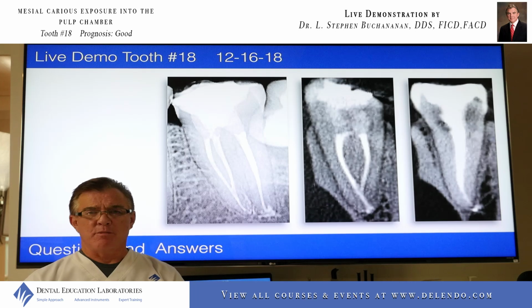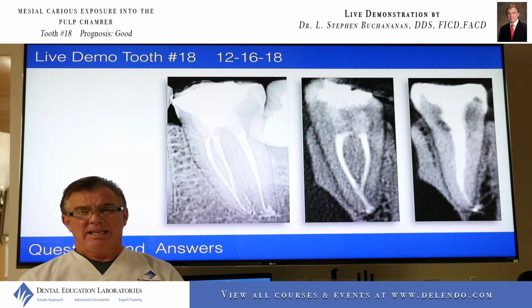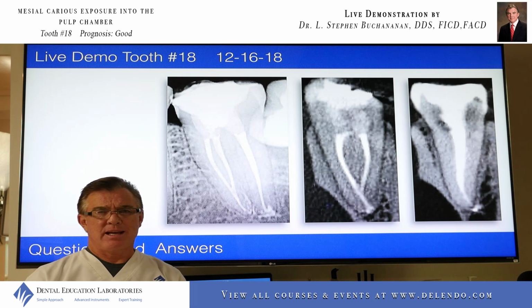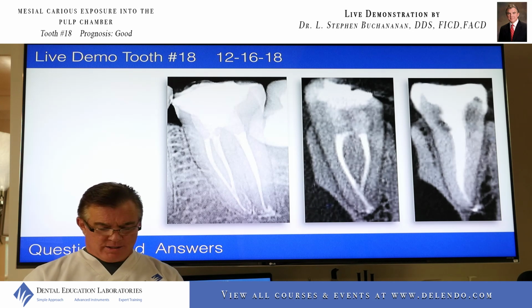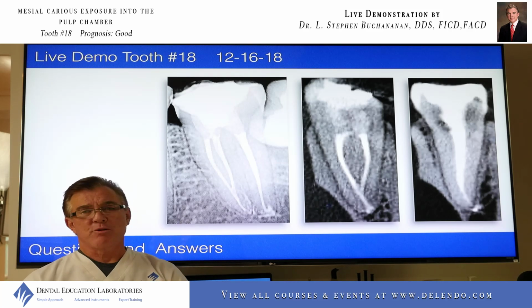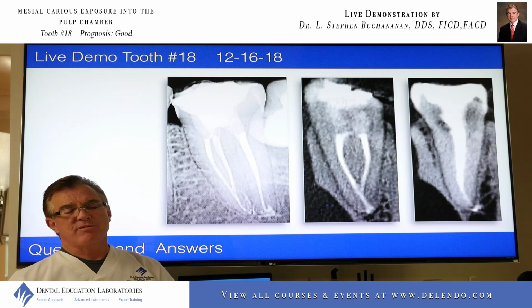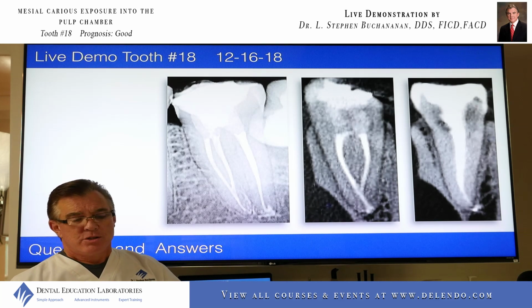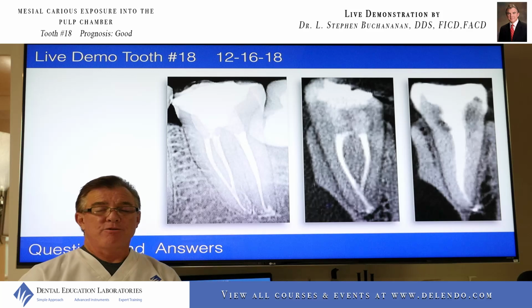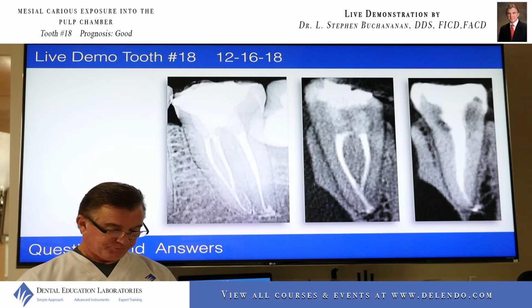Thermoseal is a hard setting epoxy. This happens to be a hard setting bioceramic, but even when it sets hard, it's a little harder than chalk. So I didn't find it difficult to remove that. Obviously, there's a gutta percha cone through the middle of it. Once the gutta percha is removed, successively larger files are used to cut any further filling material off the canal walls before doing the cleaning procedure.